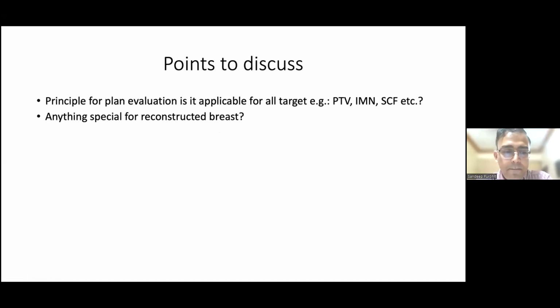Yep. So the answer is what he said, that for our junior colleagues, this is a universal law that 95% should get 95% dose. We will be looking for 95% PTV coverage. But if we stick to that, sometimes it is not possible. We need to make some compromise, say, I don't want a heart dose above 5, so then maybe I will take 90% of the internal mammary node.